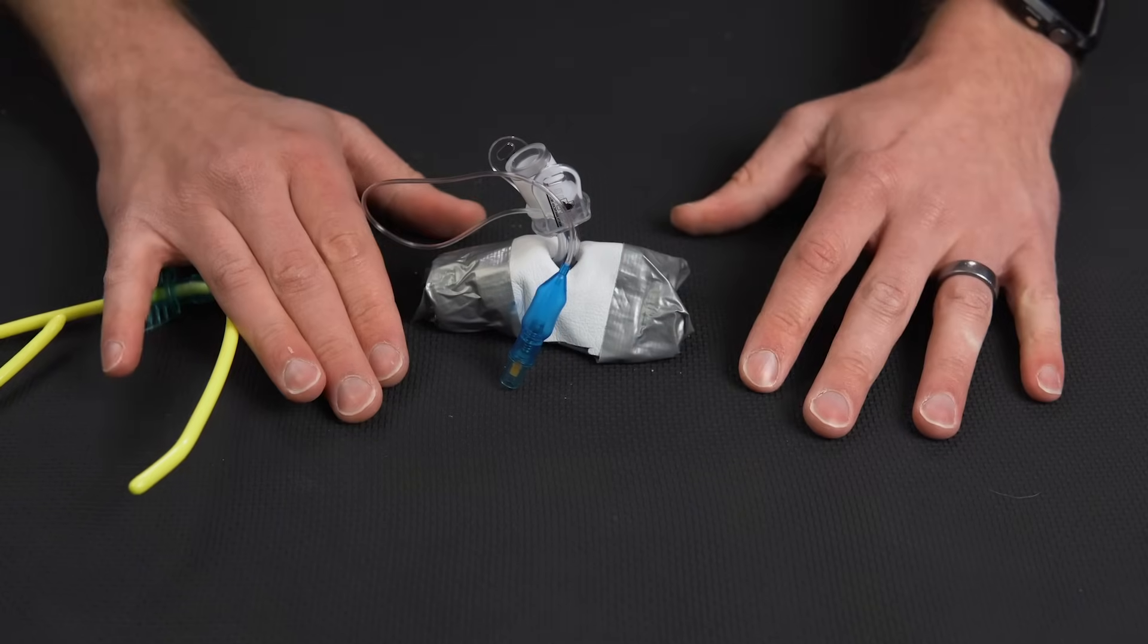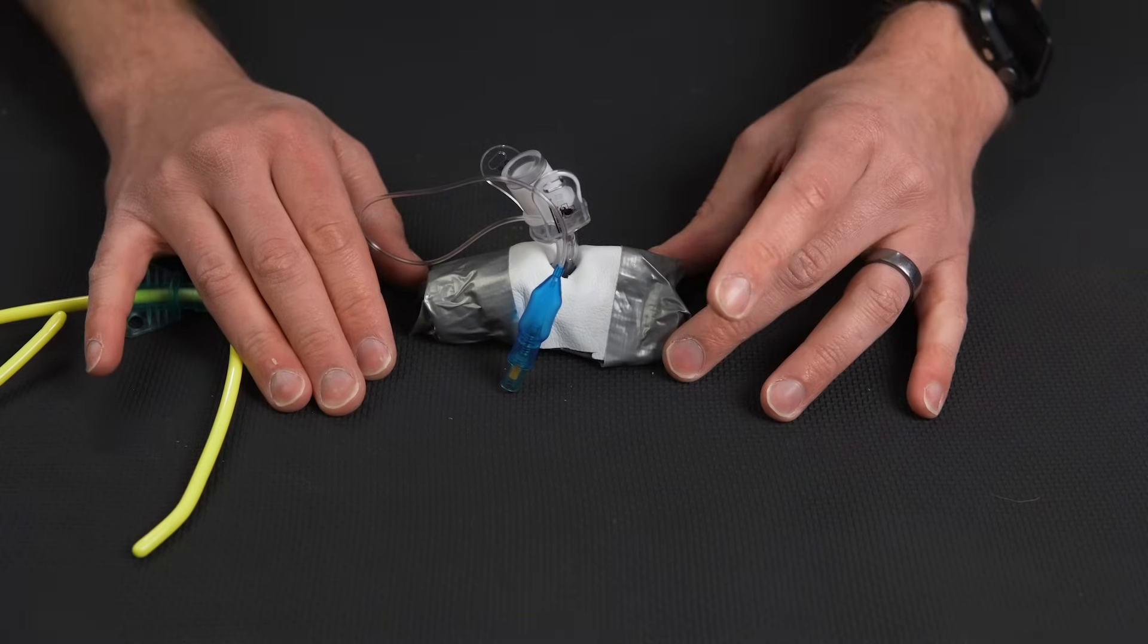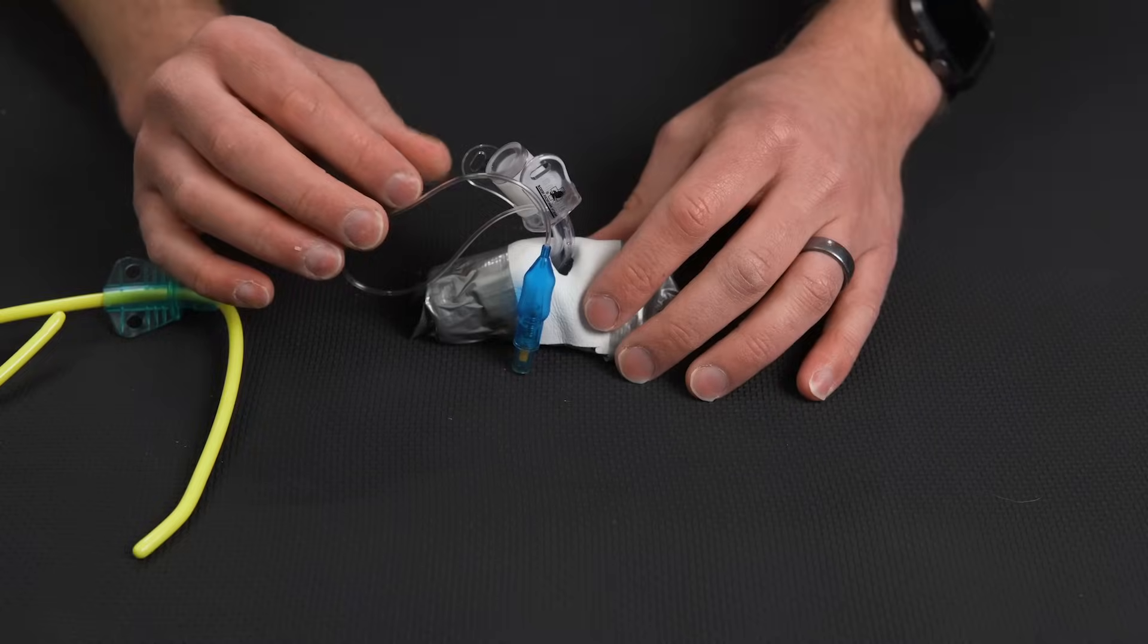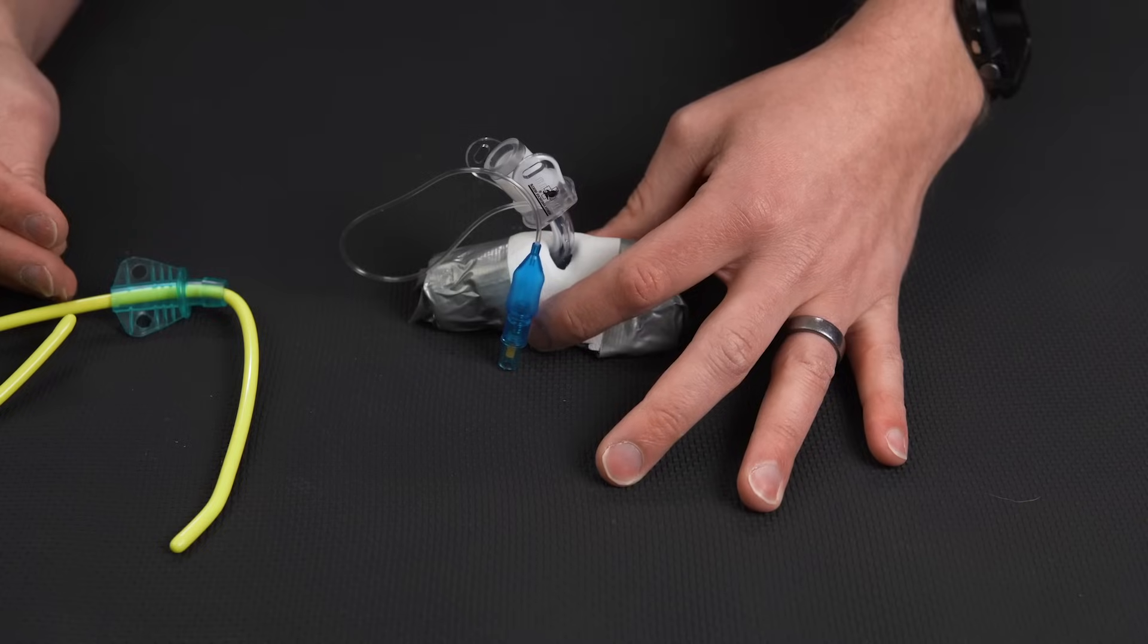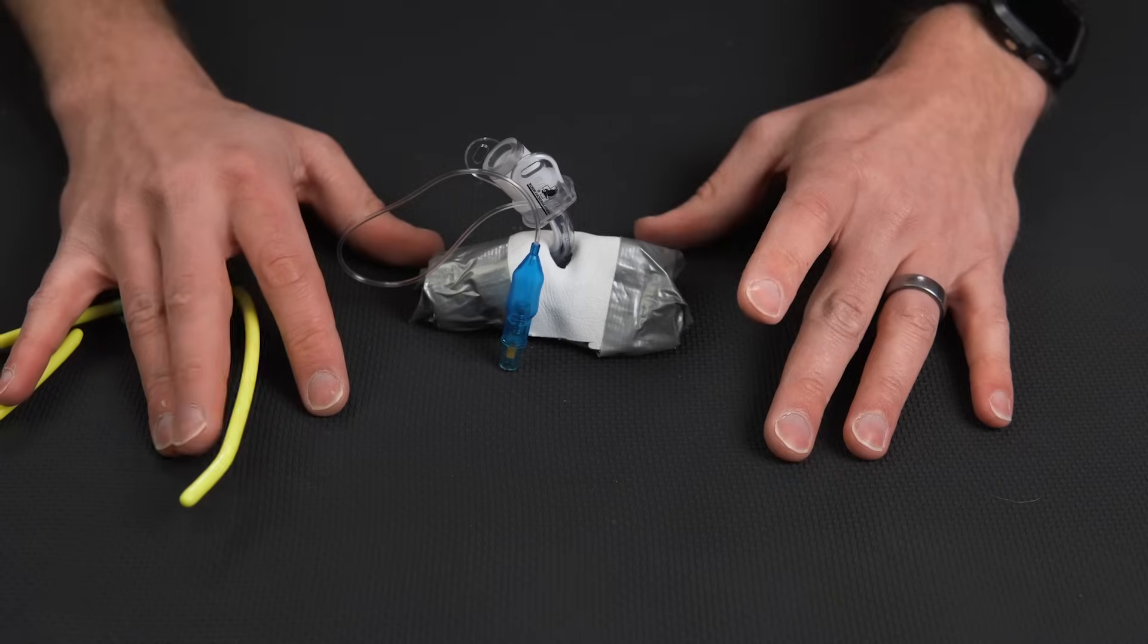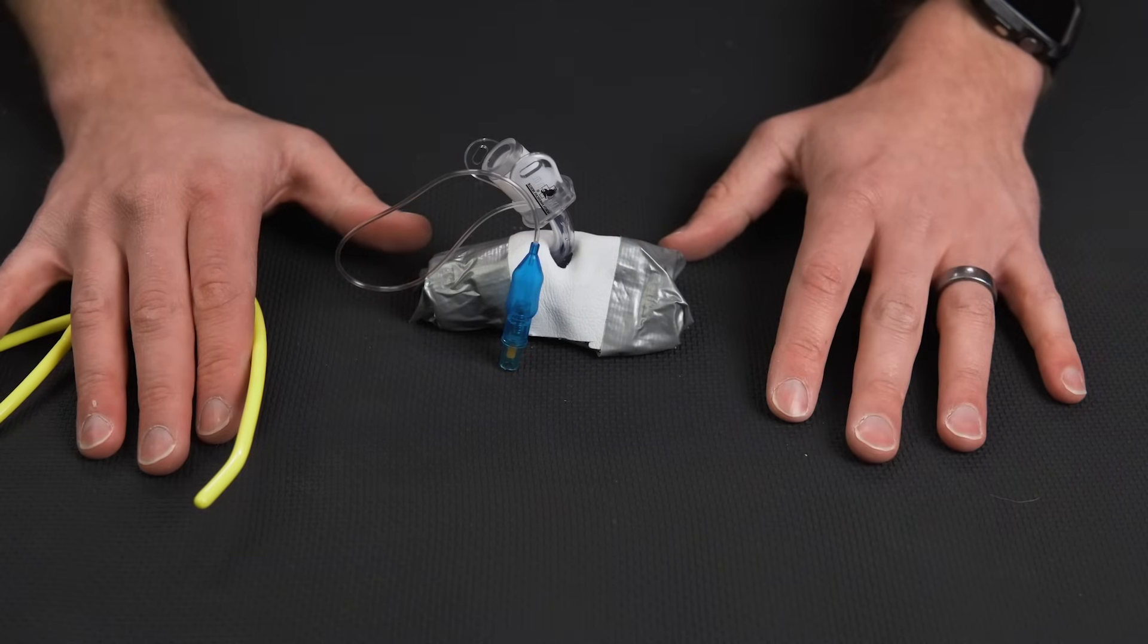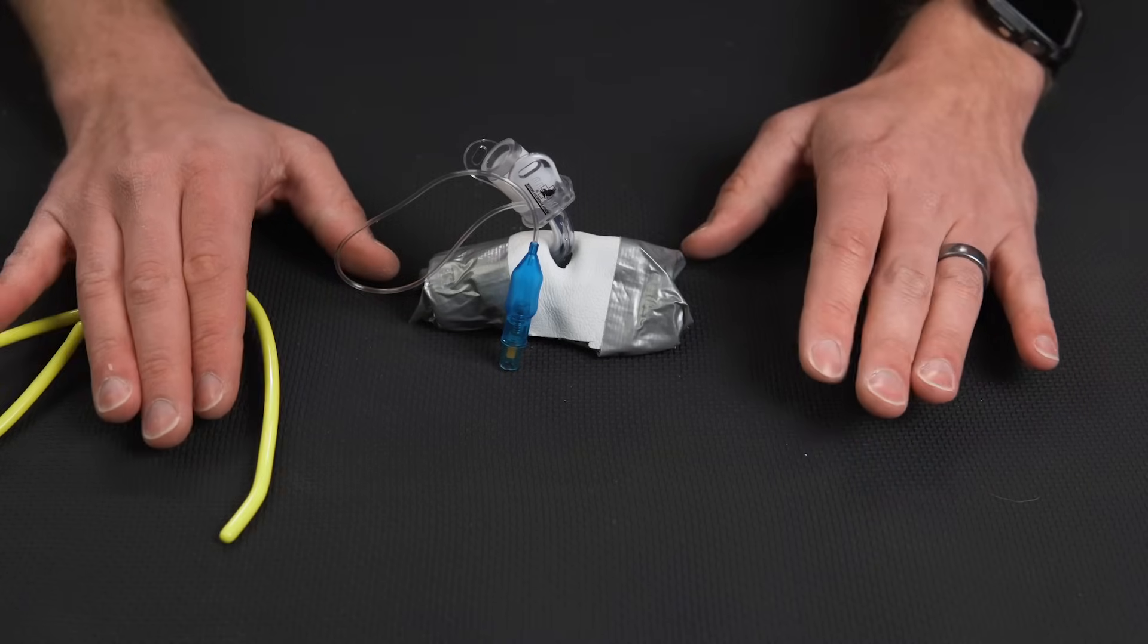One complication you may see with this that indicates a failed attempt at a cricothyroidomy is what's called a false lumen. So if we didn't do a good job at placeholding that orifice we created, or if we missed and we didn't know it, then there's a chance that this gets inserted between the skin and the trachea. And as we start bagging them, it will cause a lot of subcutaneous emphysema, which is basically air bubbles under the skin. It can also cause some very serious complications like pneumomediastinum. And most of all, you are not ventilating the lungs in this case. So preventing that false lumen and confirming it's in the right place are of the utmost importance.